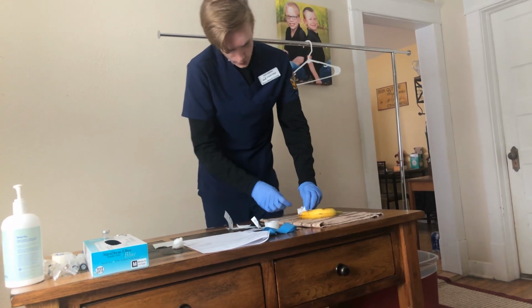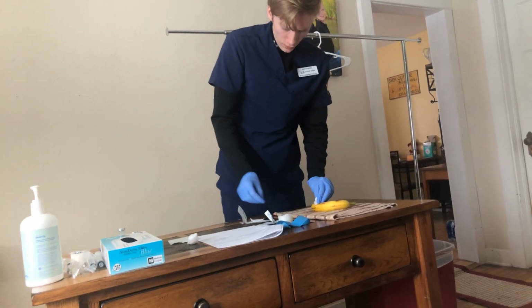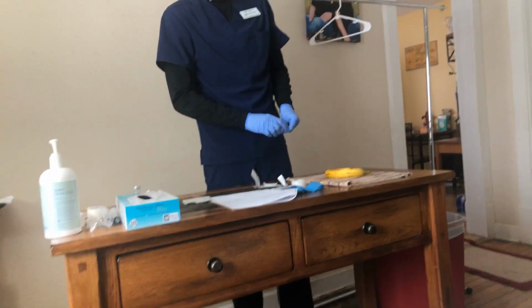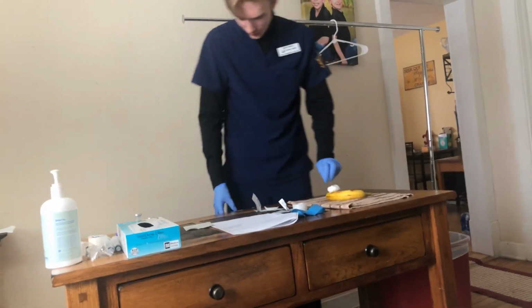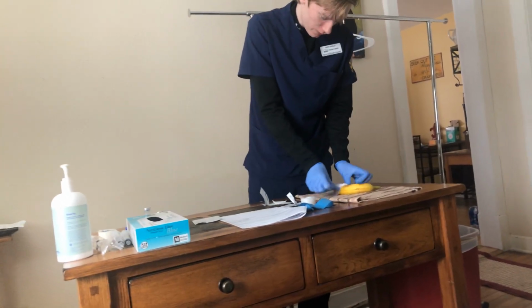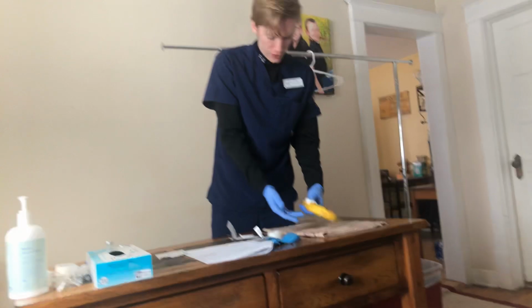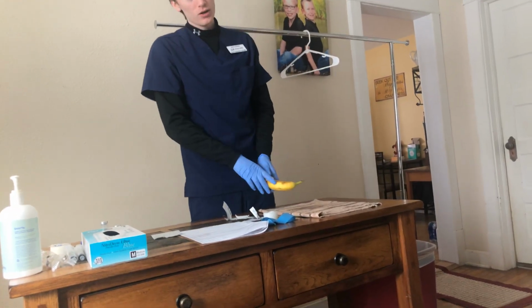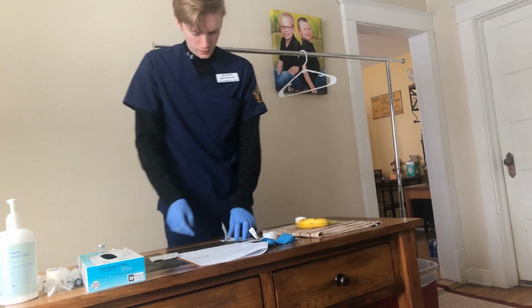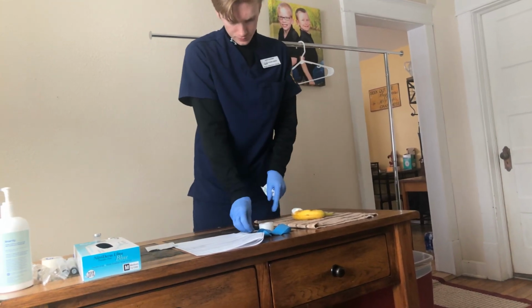Alright, now that we've held it for about 2 minutes, I'm going to discard of all this. Get an appropriate dressing, although which I do not have, so we're going to use another cotton ball. Get a big piece of tape that I also have, and then just tape it over the site. Instruct the patient to leave it on for 20-30 minutes, just to be safe. Leave that on. Clean up my area.